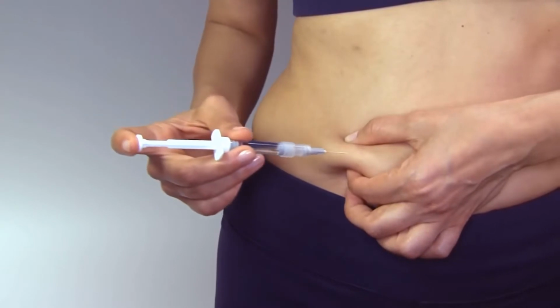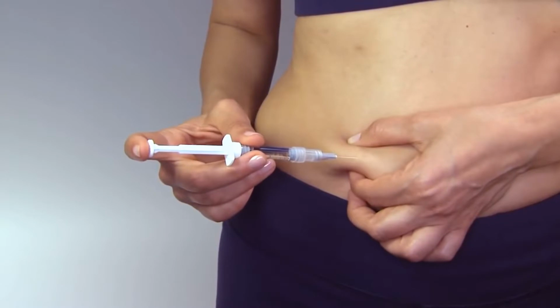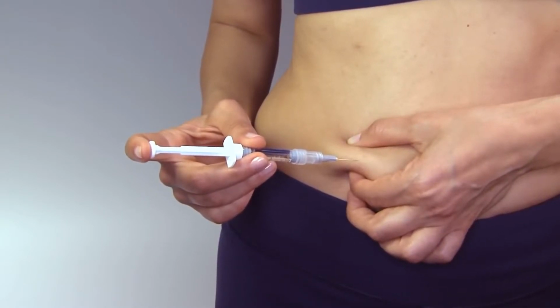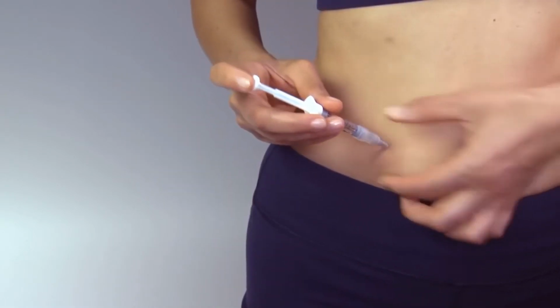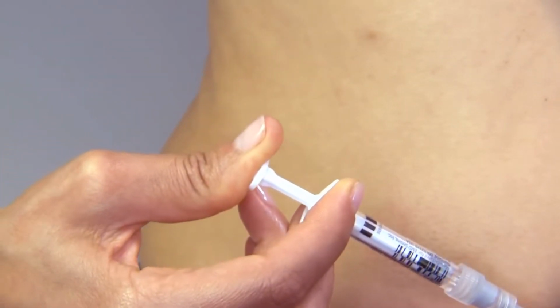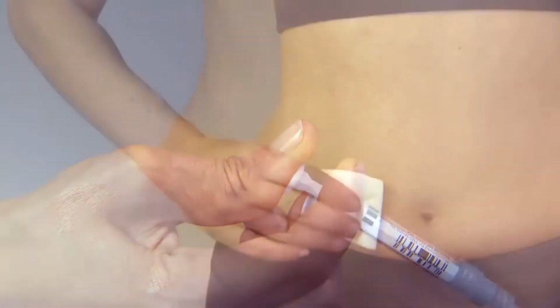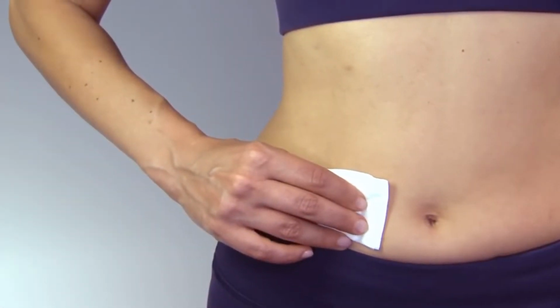Insert the entire length of the needle into the skin at an upward angle of about 45 to 90 degrees, as indicated by your doctor or nurse. Release the hand pinching the skin and depress the plunger in a slow, steady motion until all the medication is injected. Gently withdraw the needle and apply pressure to the injection site by using a gauze pad.